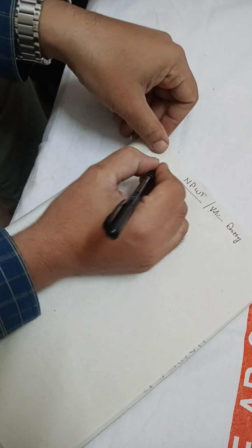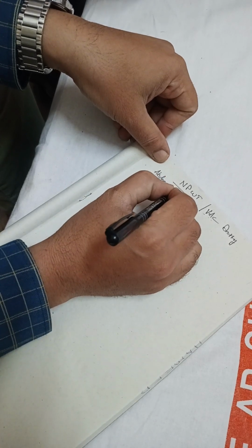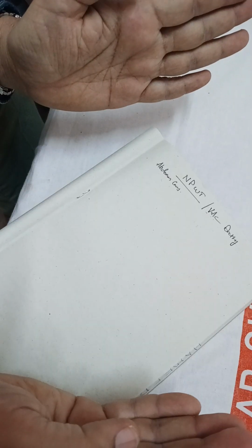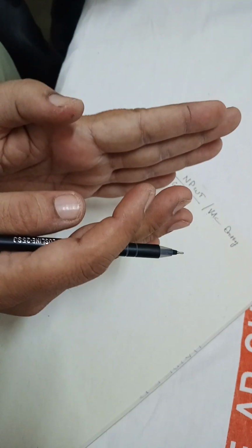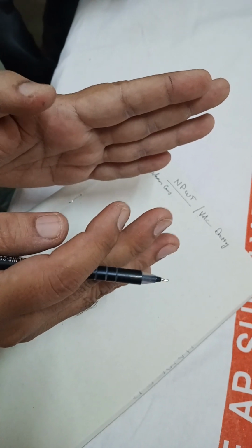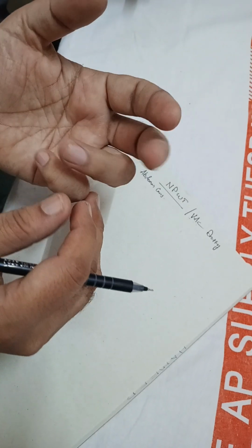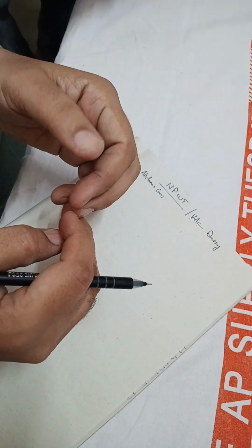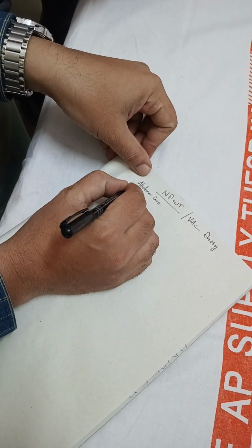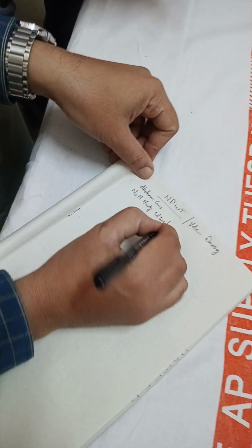Okay, so this was initially designed for abdomen cases, wherein the abdominal wall could not be approximated and closed in certain cases. So it was developed by certain surgeons for that initially, but later on it has so many benefits, and it was expanded to other wounds. So right now it is mainly indicated for non healing ulcers or wounds.